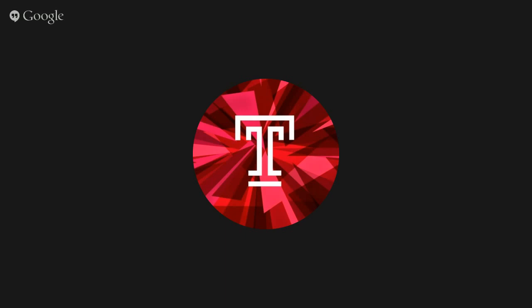In other words, you have to have both to really develop lateral epicondylitis. So the most common, this is a coronal T2 weighted image. I keep forgetting my audiences. I just assume that this is a radiology audience. So this is the humerus, that's the ulna, I'm sorry, that's the radial head, that's the ulna, and that's the common extensor tendon right here.